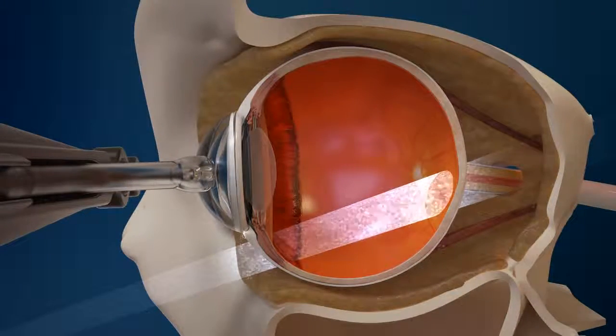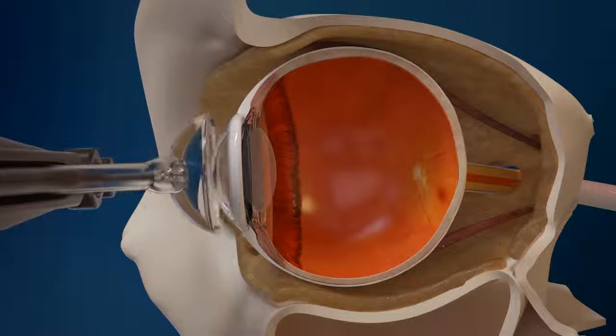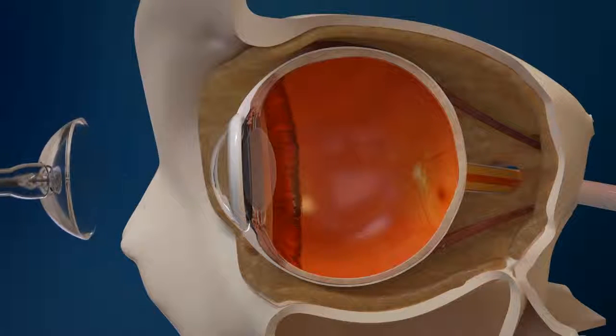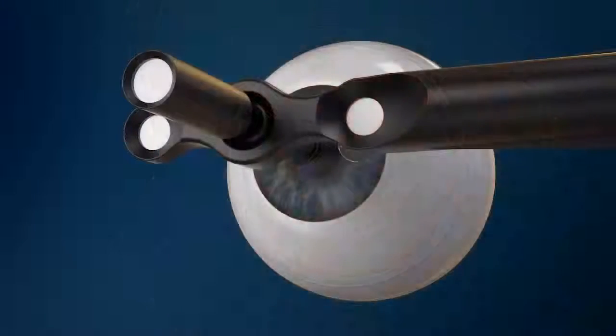Minimal doses of radiation are deposited to areas outside of the targeted foveal zone, and the patient receives a total body effective dose that is comparable to 1/10 of a head CT scan. Following the radiotherapy treatment, the eye guide is disengaged. The patient is able to leave at the conclusion of the procedure with routine follow-up.